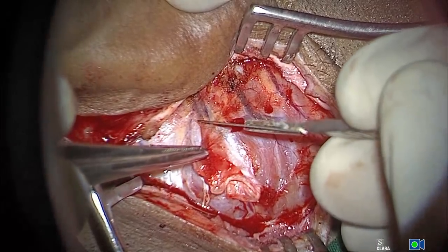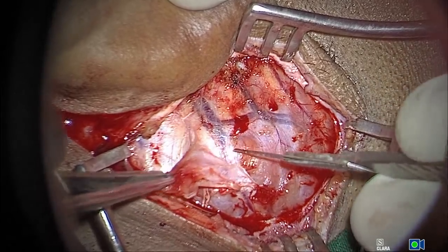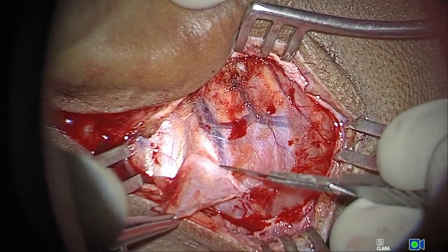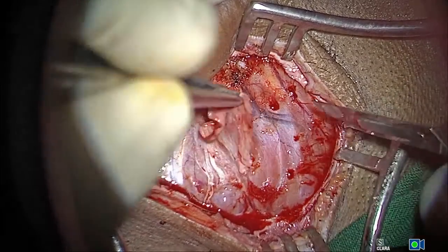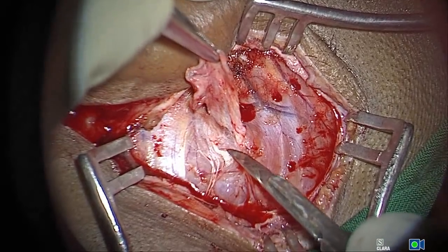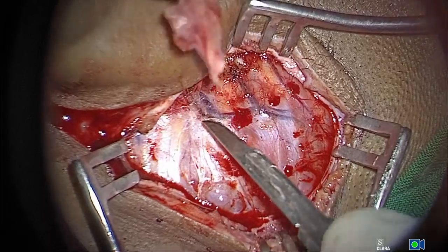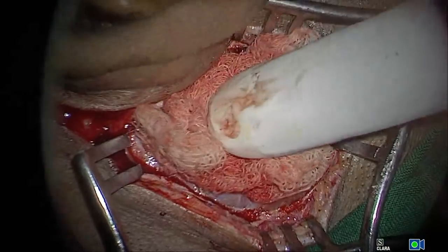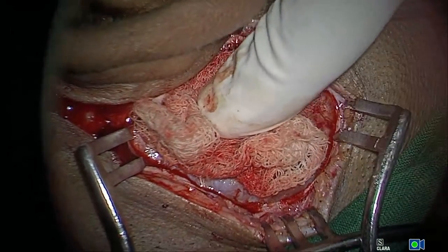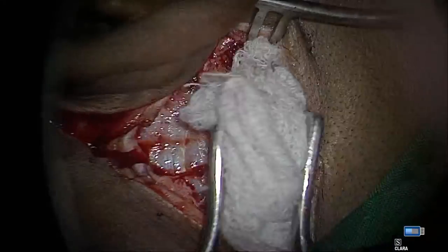It's important that you take only the layer of the fascia and you leave the muscle layer. Of course, some people inject a little saline. That's also a good technique. So this is all I need to close the perforation. I'll just spread the graft and allow it to dry. Sometimes we just allow it to dry if we think it's going to take some time, or else we use a hair dryer.